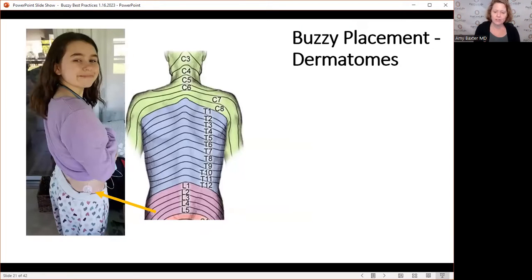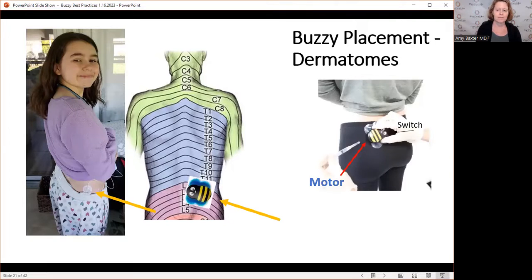For the hips, same kind of thing. Just make sure that you test it before, but just know that for the L spine and for the thighs, it's going to curve around the buttocks and then move over into the front and be a little curvy. For IVF or in the back, you're going to want to put it almost on a diagonal, up and centrally.